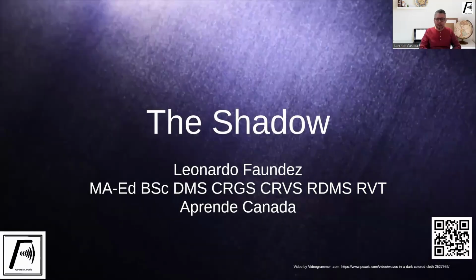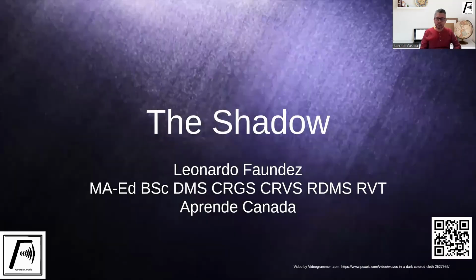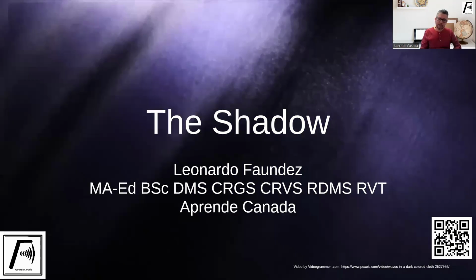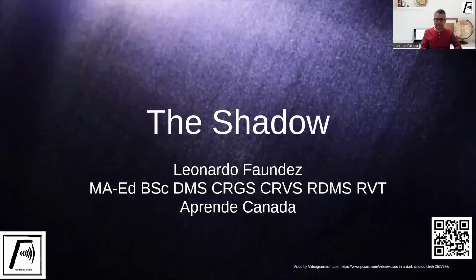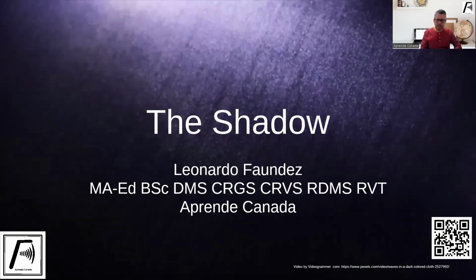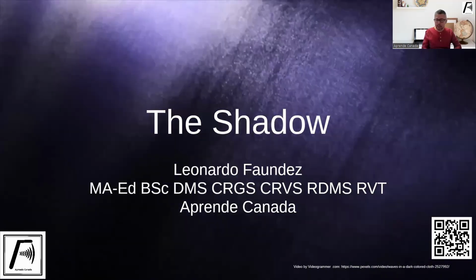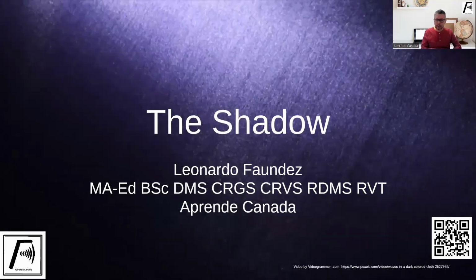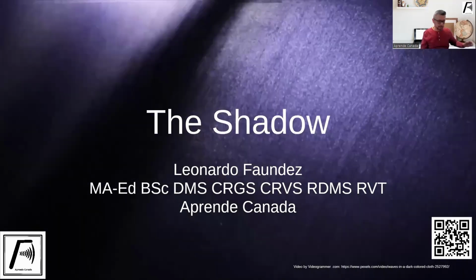Hello, everyone. Thank you so much for watching this new free video on the shadow. I'm going to be talking about that subtle and sometimes strong shadow that we may see when we're scanning the thyroid, and how this shadow, sometimes we can recognize it as such, but sometimes it can mimic abnormalities. And so the idea is to be aware of it and how can we get rid of it.